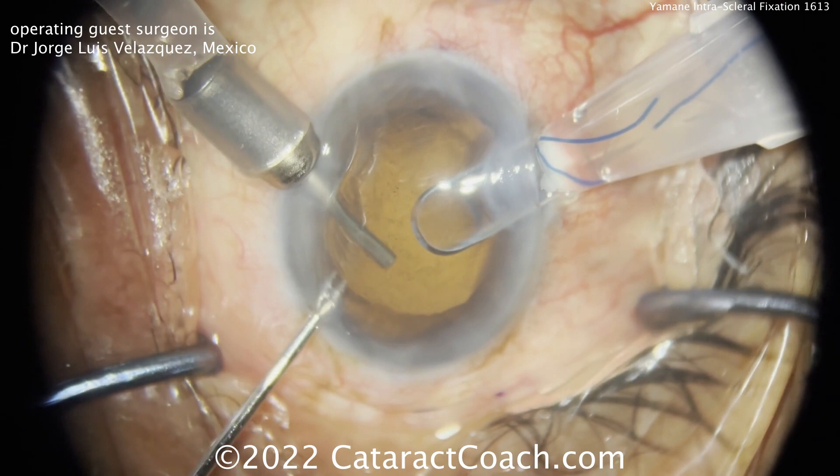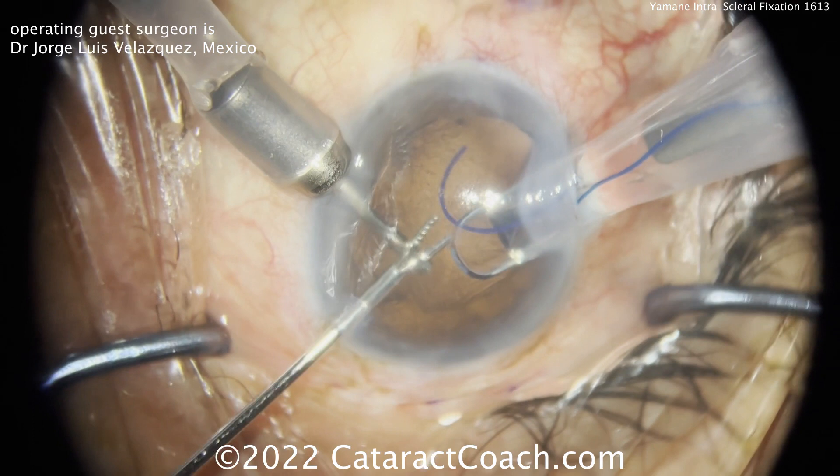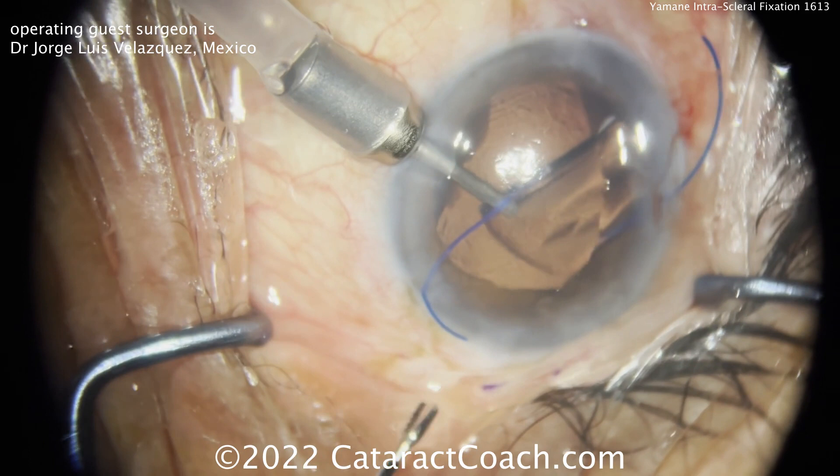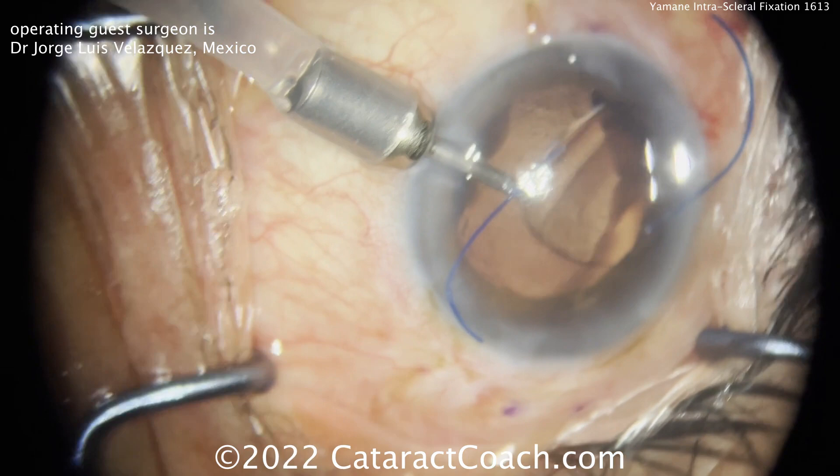This Brian Kim modification involves going in through a paracentesis, grabbing that leading haptic, and pulling it out of the paracentesis while slowly advancing the lens. Notice how the lens is staying planar right there at the iris plane. With one haptic outside via that paracentesis, the Yamane technique can now be performed.